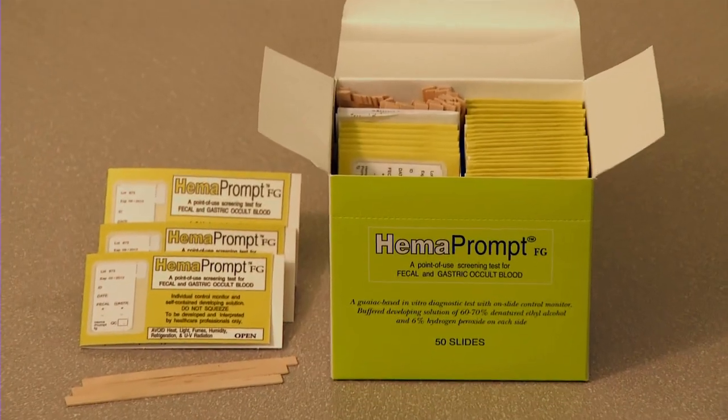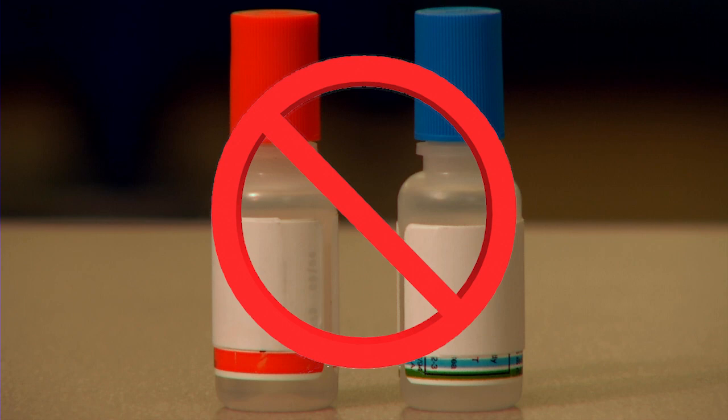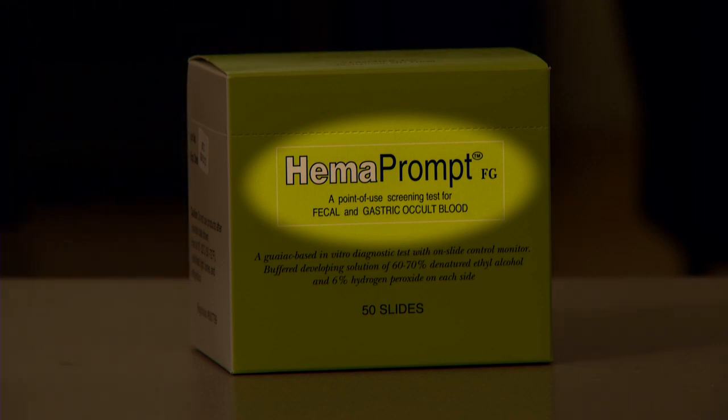You're about to see HemaPrompt FG. It's an easy-to-use, GUIAC-based occult blood test that's FDA-cleared and CLIA-waived, and it's perfect for point-of-care testing. HemaPrompt FG has several very unique features that beat any other occult blood test on the market today. The test is self-contained — there are no developer bottles to lose or mistake for other reagents. HemaPrompt FG is a two-in-one test that can be used for fecal or gastric specimens.